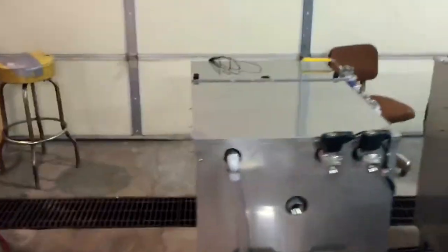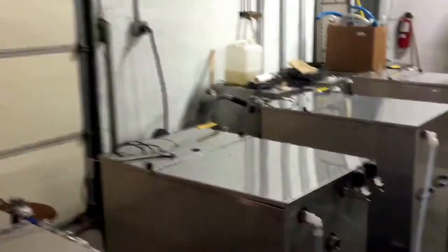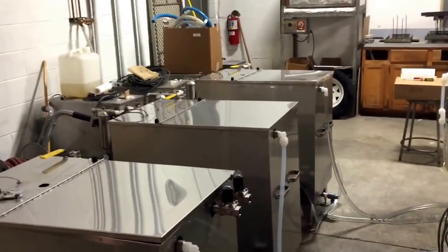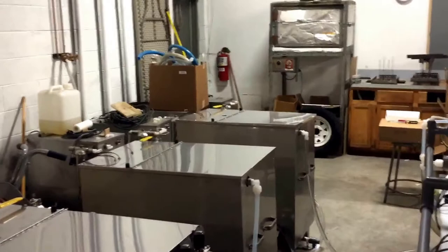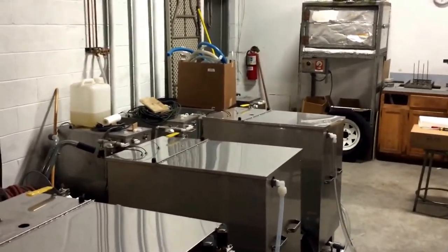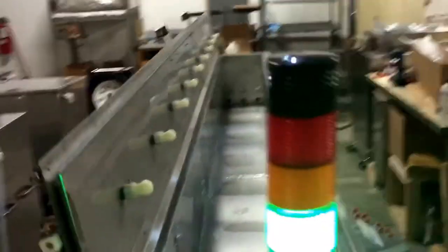There are storage tanks: DI rinse tanks with conductivity meters, a third tank which is an alkaline wash tank, and a last tank which is a citric acid passivation tank. All these storage tanks pump solution into the process tank.